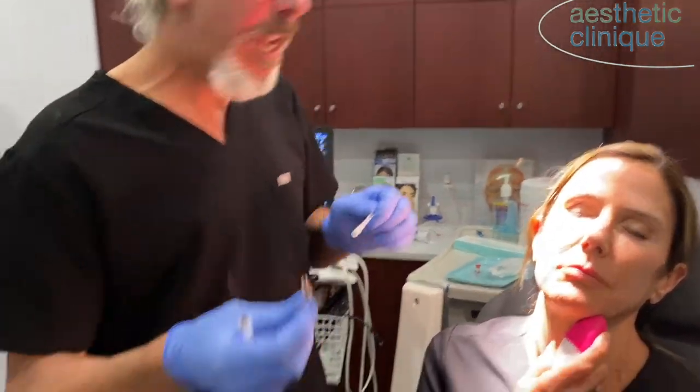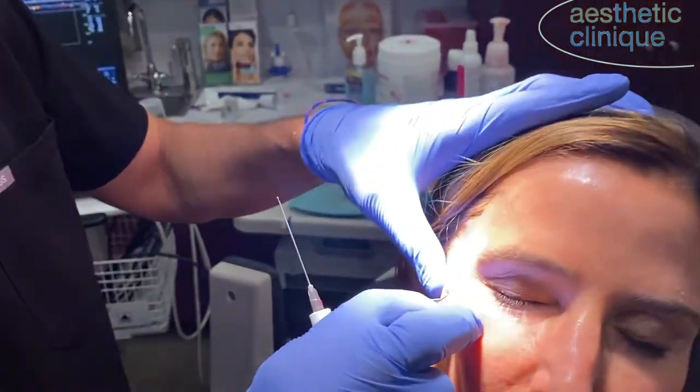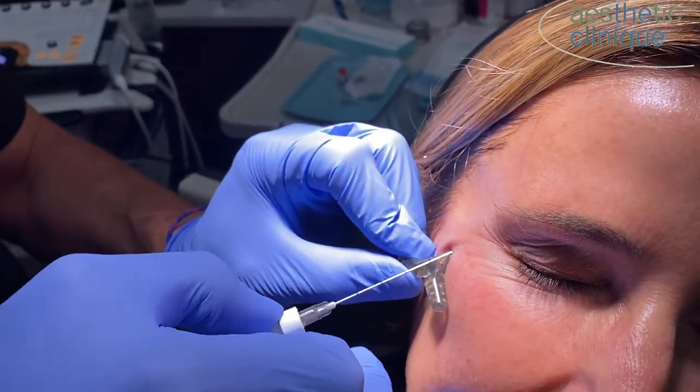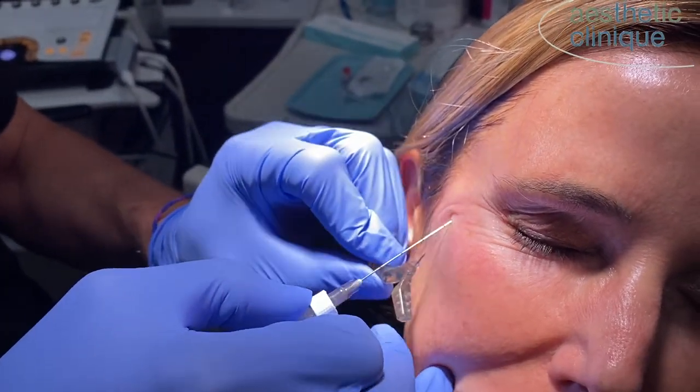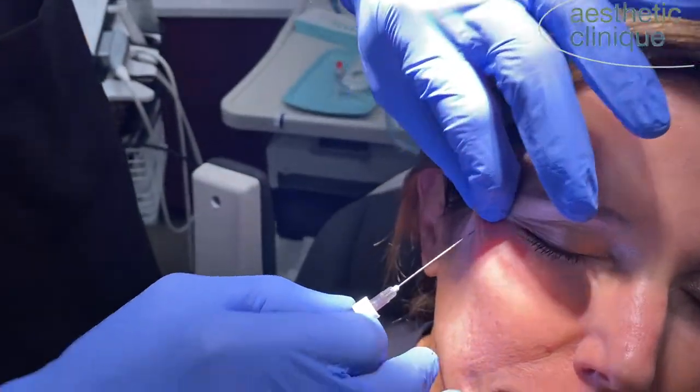I use a 22-gauge cannula. I use soft fill — that's my preference. And I use the EasyGuide system here. I like the 22-gauge because the larger the cannula, the less likely it is to pierce the vessel.